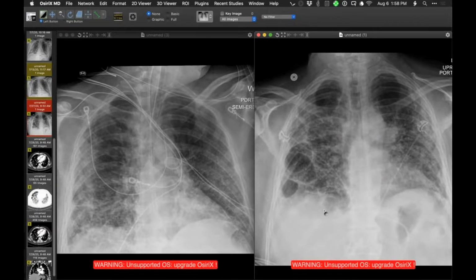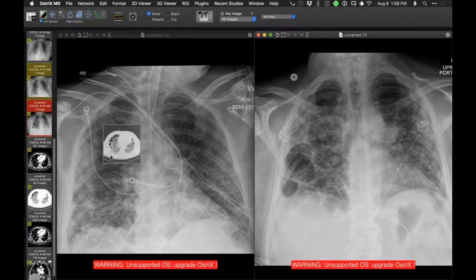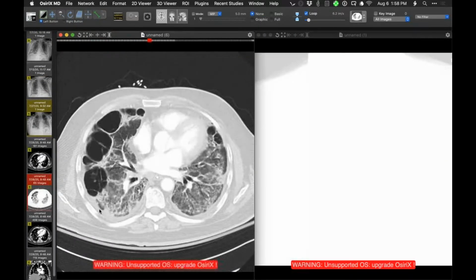Yeah, we've seen that in some bad cases. You wonder if some of it's cicatricial, just this rapid pulling on the lung versus kind of the slower stuff we see with UIP. The rapid contraction, I don't know. But yeah, I've seen some cases, definitely. That is fast, but yeah. Yeah, pretty dramatic, huh?